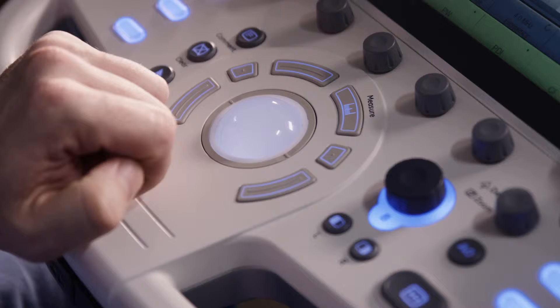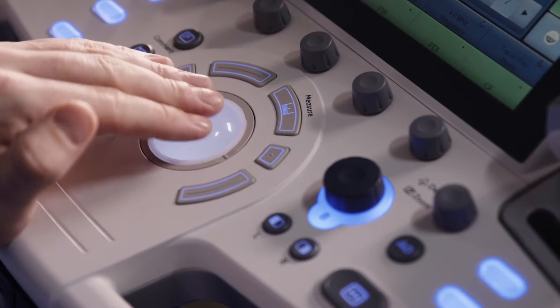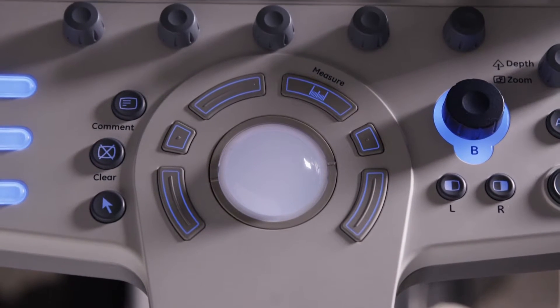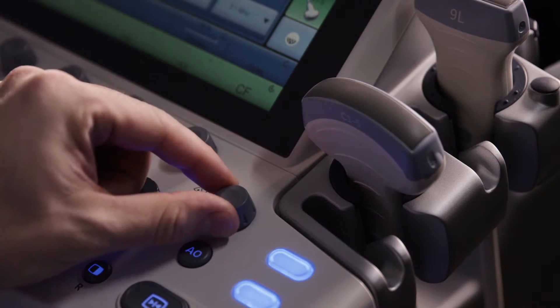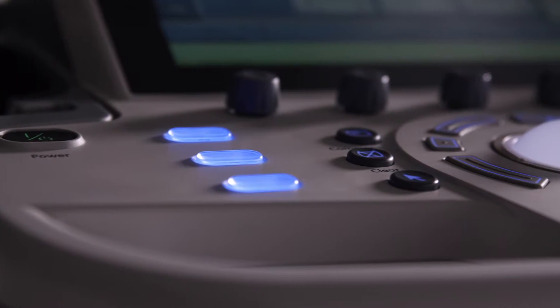The console is designed for simplicity and ease of use. A convenient trackball provides movement of functions such as annotations and measurements. It is surrounded by trackball keys and smart buttons that offer useful functionality per mode. Modes can be accessed at the rotary keys. Depth and zoom buttons are conveniently located, and all console buttons are backlit to enhance workflow.